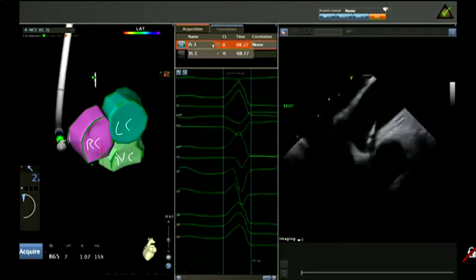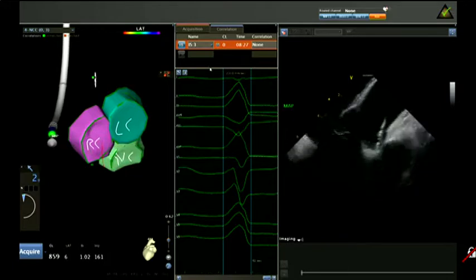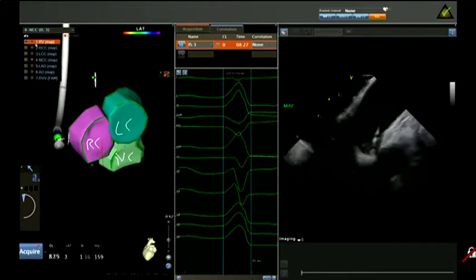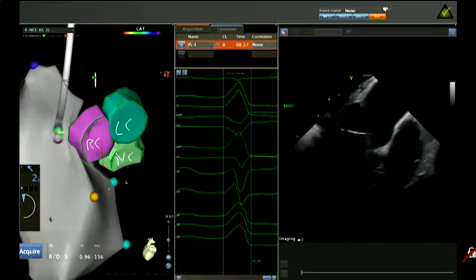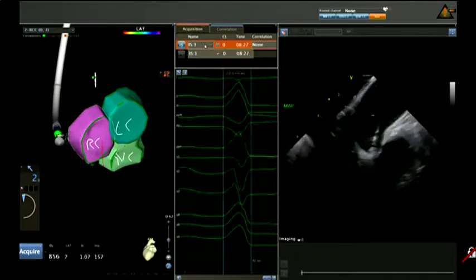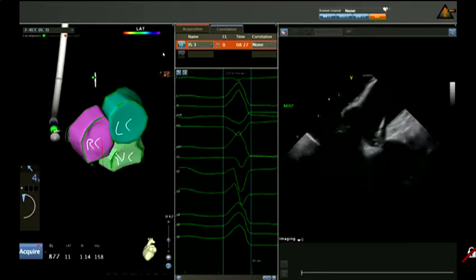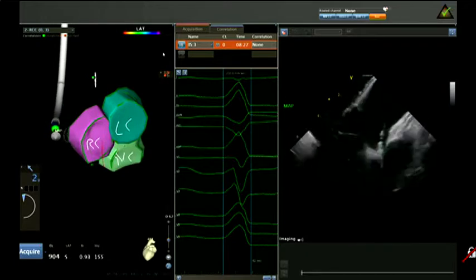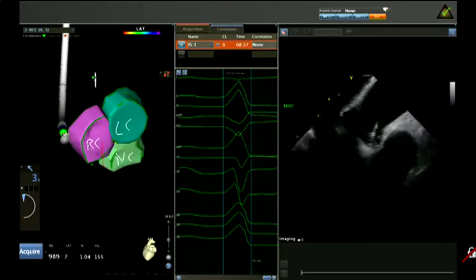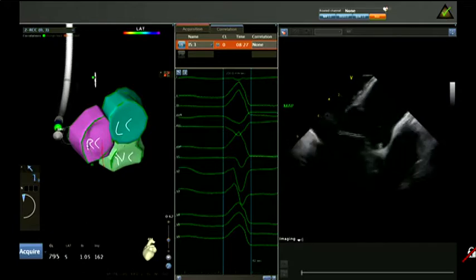The ECG that you are showing has differences with the clinical ECG that we showed before, unless there is a mistake with the leads, because this is a left bundle branch block with an early transition towards V3, but lead 1 is positive with a lower axis, but we no longer see the negative prevalence that we saw before in AVR. So probably it's more positive D2 than D3, and probably more negative AVR than AVL.